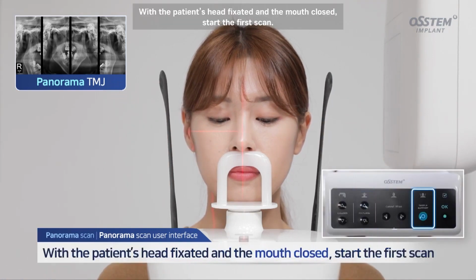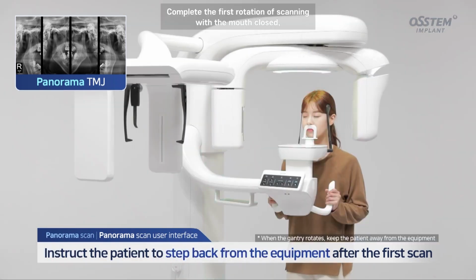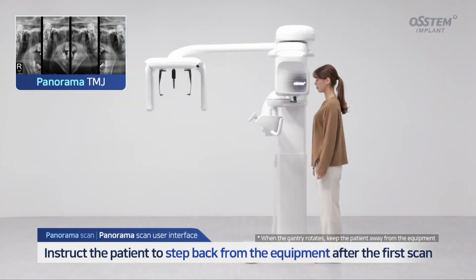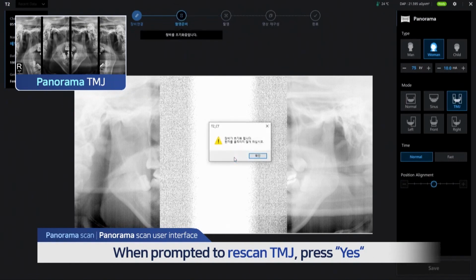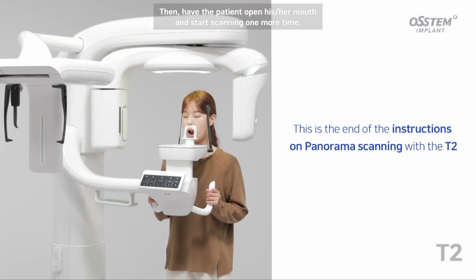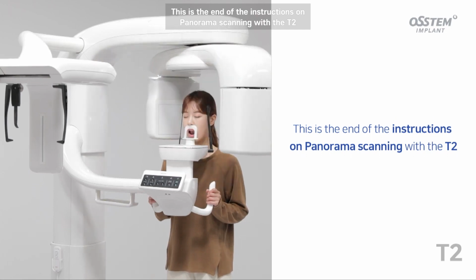With the patient's head fixated and the mouth closed, start the first scan. Complete the first rotation of scanning with the mouth closed, and have the patient step back from the equipment. When prompted to rescan TMJ, press yes. Position the patient in the same manner as before. Then, have the patient open his/her mouth and start scanning one more time. This is the end of the instructions on panorama scanning with the T2.